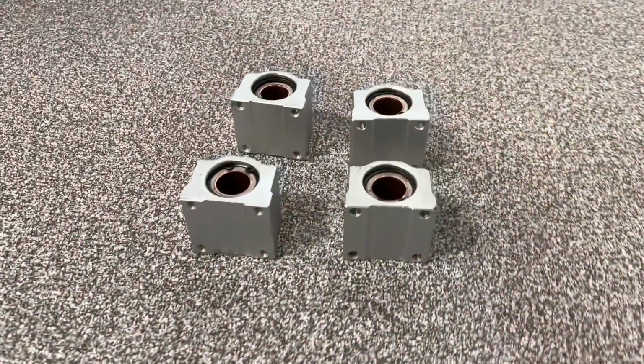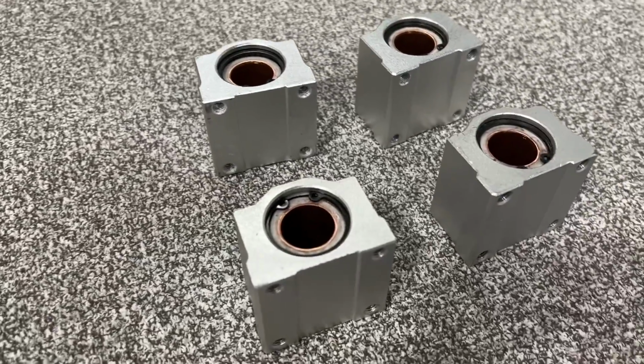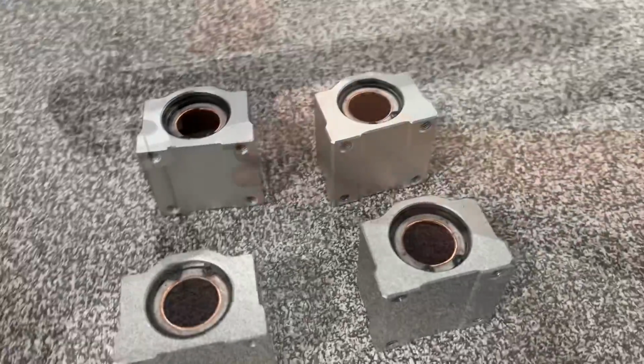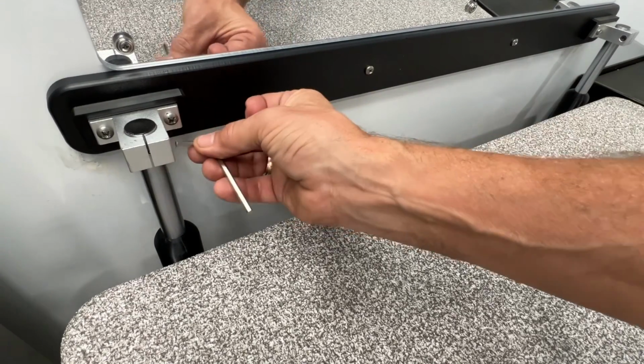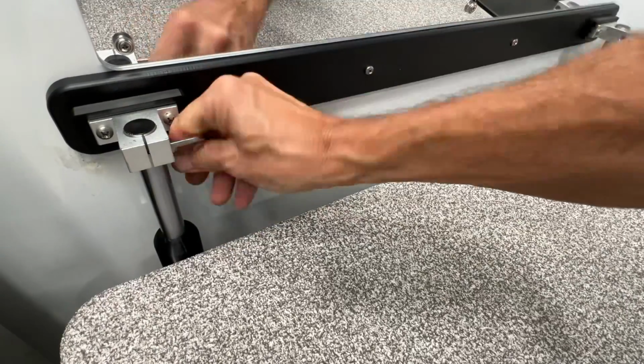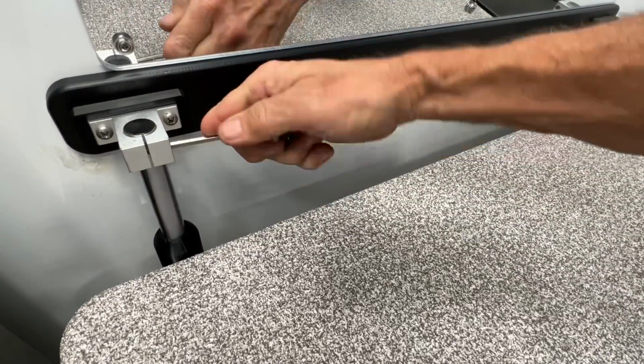Let's talk about swapping out the bearings on your HANVEY elevator table. You will get a kit that has 4 bearings, like you see here, and an Allen wrench. Now what we're going to do first is take this Allen wrench and loosen the top holding bracket for the rail. You only have to do it until you feel the screw get loose.